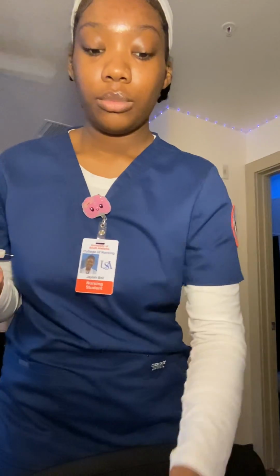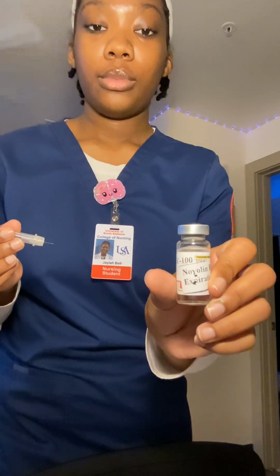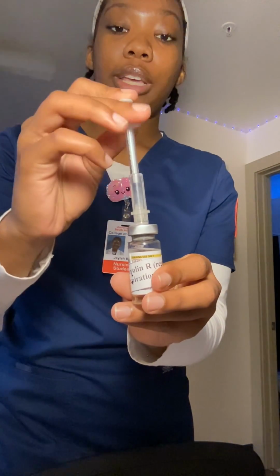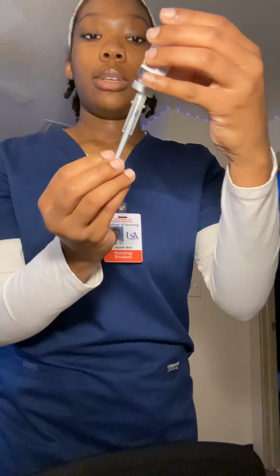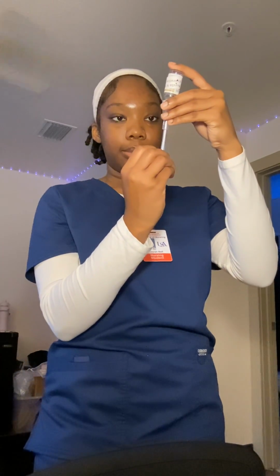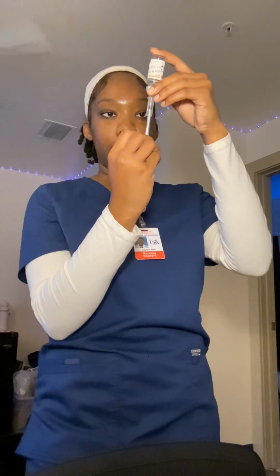I'm gonna take off the top. I'm just gonna push that air in. Now we're going to actually draw back 10 units of insulin, making sure there aren't any air bubbles.